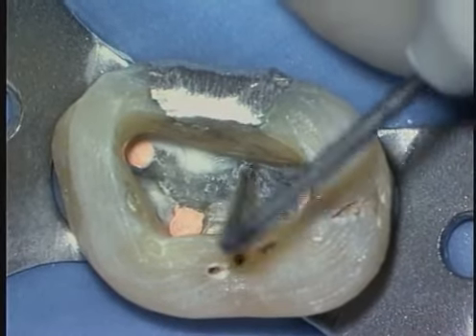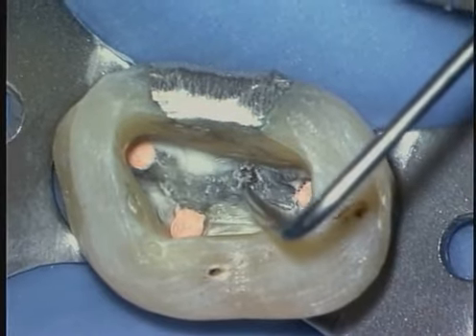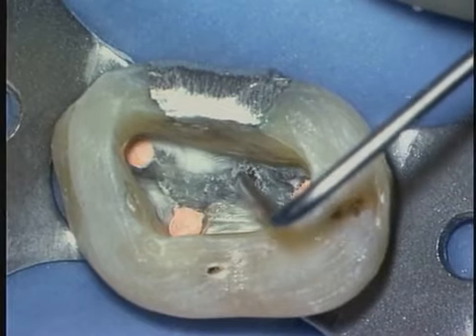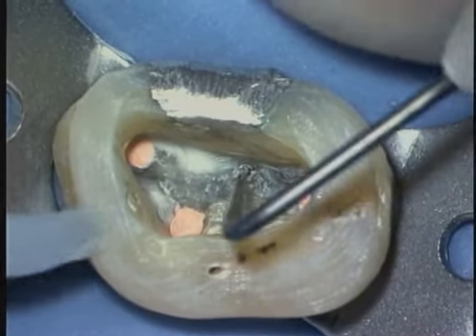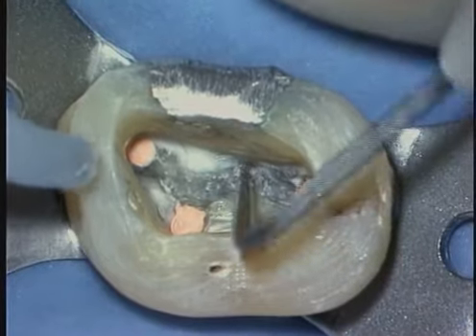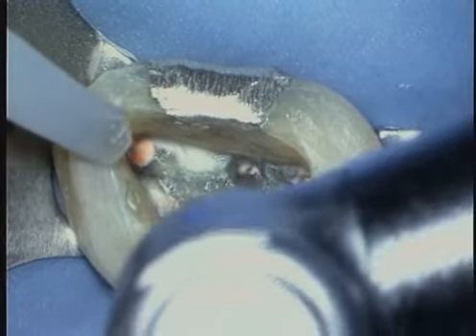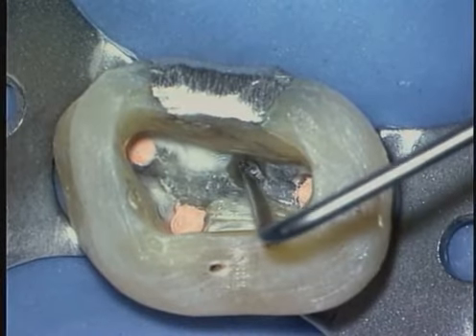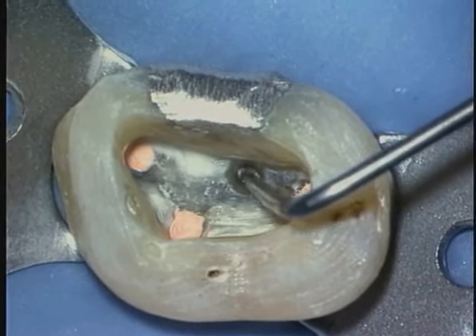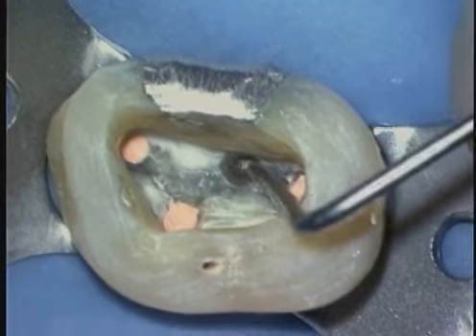The micro opener is an excellent instrument and can be used to begin to open up the mouth of the canal. Moving the instrument and cutting towards the buccal and then cutting a little bit towards the palatal begins to funnel the orifice level so that the instrument can proceed a little bit deeper. Again, the Gates Gliddens are used not to travel down the root, but just to be kept and limited to the level of the orifice. By facing off the orifice and removing more restrictive dentin, the micro opener can now pass in deeper.